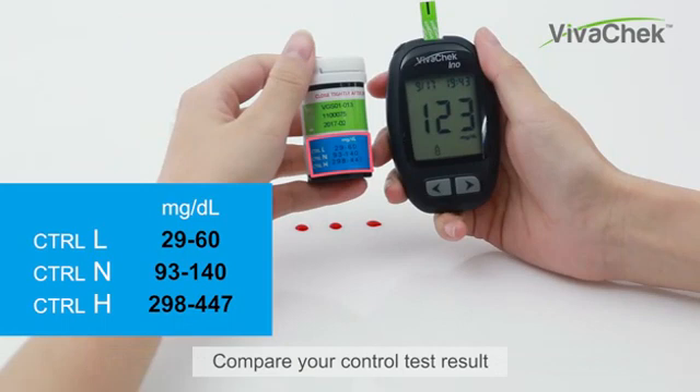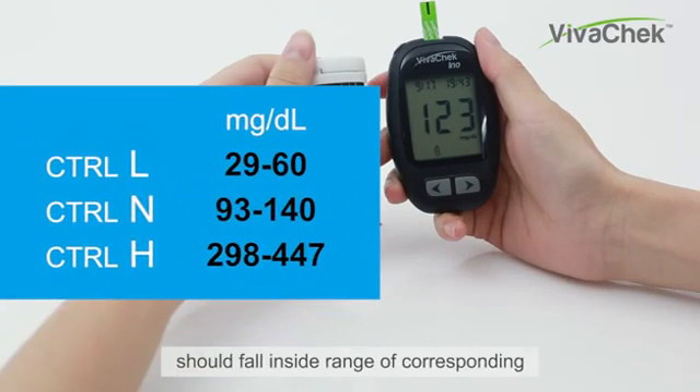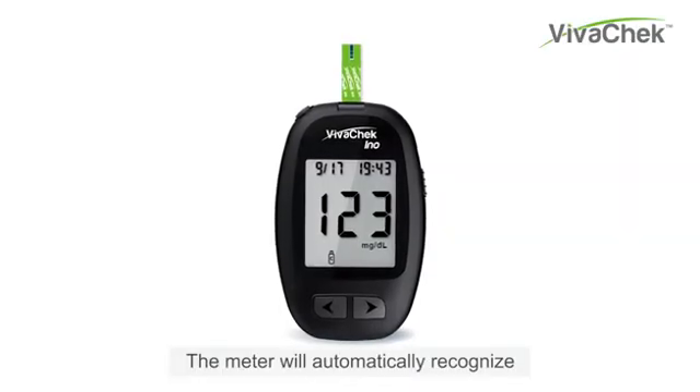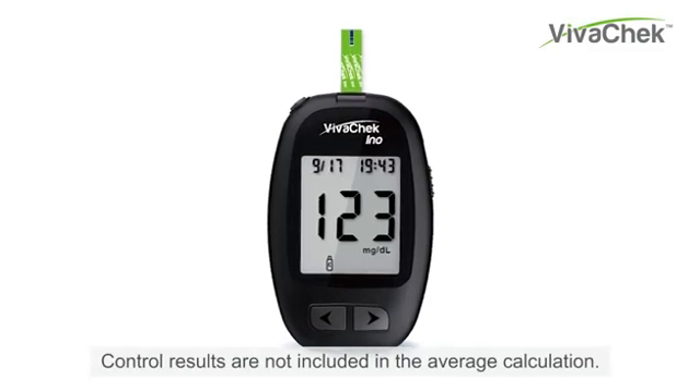Compare your control test result with the ranges printed on the test strip vial label. Make sure the control result falls inside the range of the corresponding control solution level you used. If the control result is outside the acceptable range, refer to the user's manual or contact your VivoCheck local dealer. The meter will automatically recognize and mark the control result for you. Control results are not included in the average calculation.